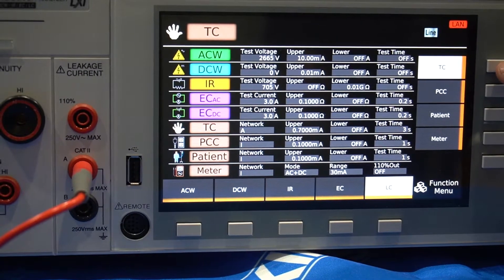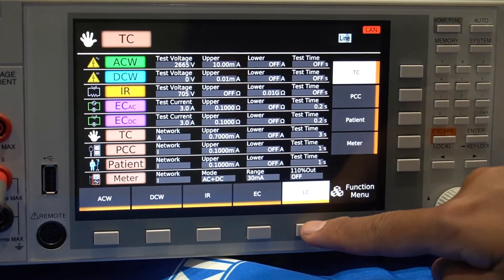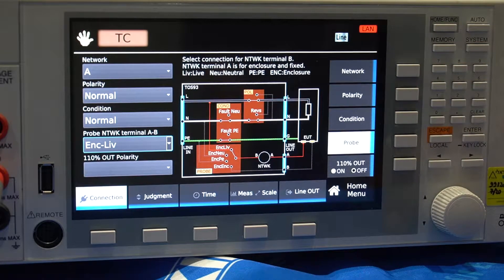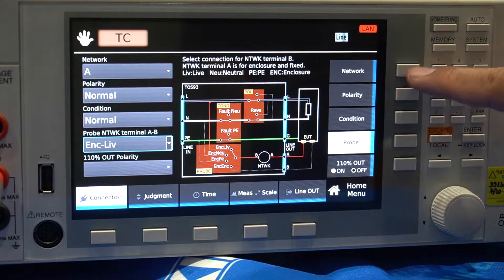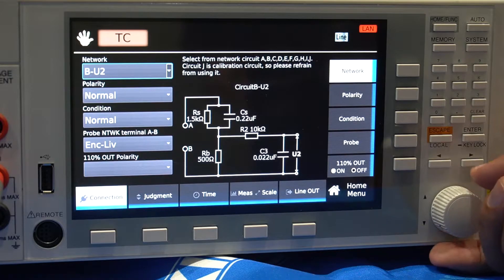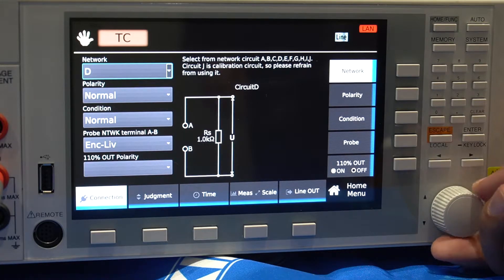On the panel, select LC for leakage current, then select TC for touch current. Next, select your desired network based on your test requirements — toggle them by turning the knob. For the purposes of this video, we will use Network A.